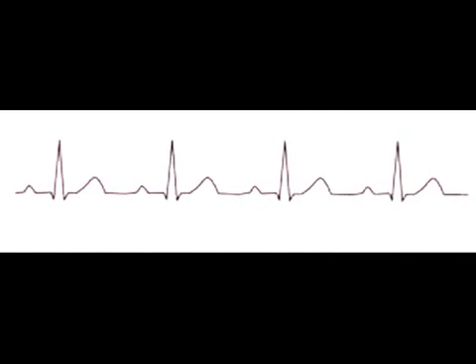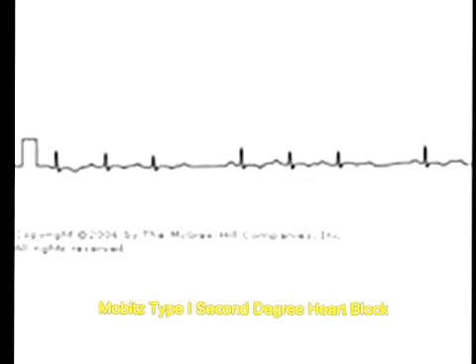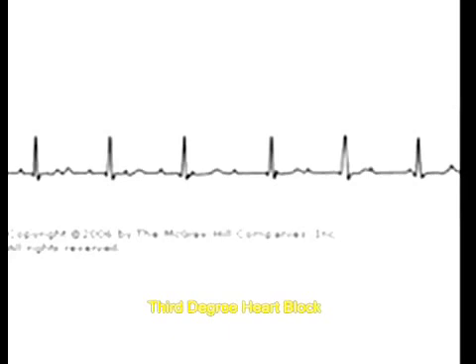In this EKG you will see increased PR interval — you can observe how the PR interval is more than 0.2 seconds. Normal PR interval is between 0.12 to 0.2 seconds. This increased PR interval is characteristic of first degree AV block. In second degree Mobitz type 1, the PR interval increases progressively until a P wave is dropped. In third degree AV block, both atria and ventricles contract independently.